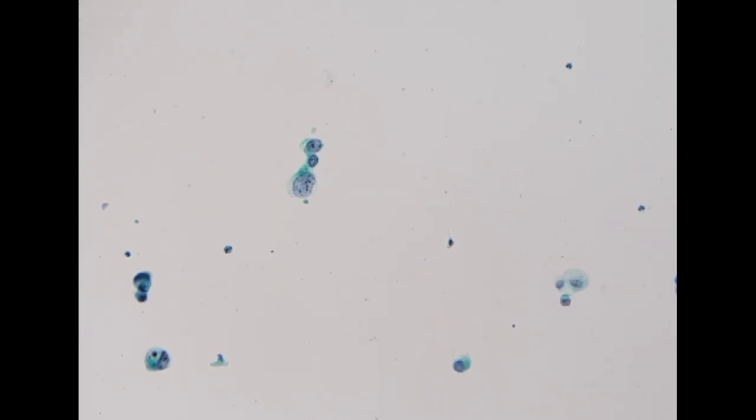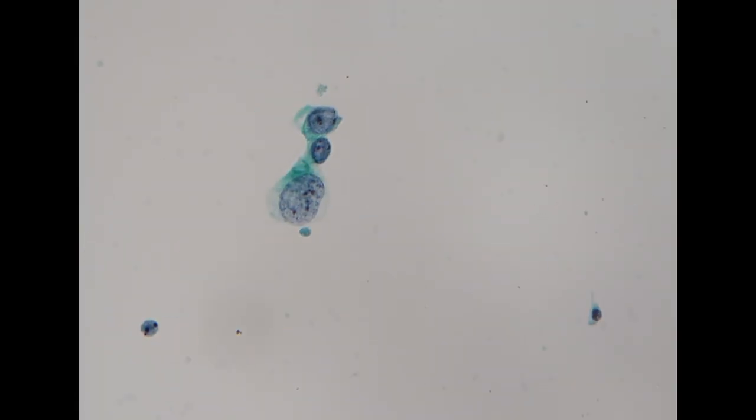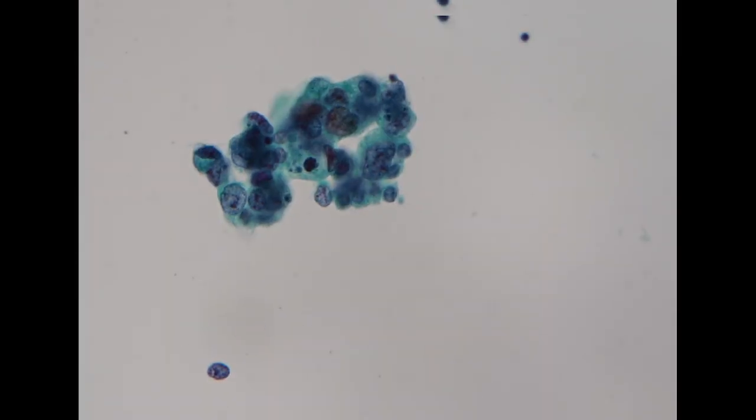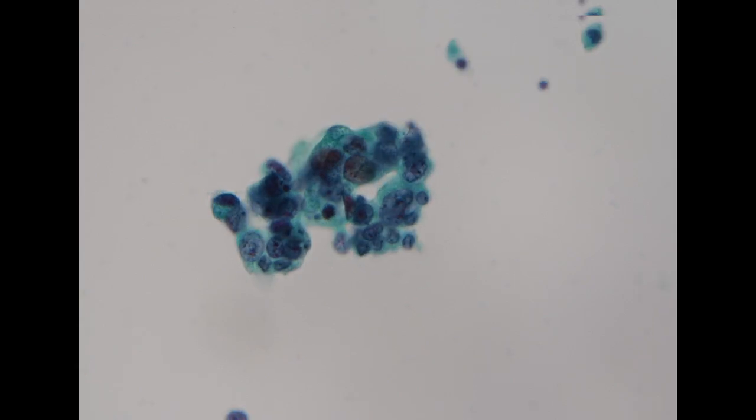So these cells in the background showing this single cell pattern are easy for the diagnosis, compared to the aggregates of high-grade urothelial carcinoma cells. Sometimes in aggregates of cells it is not easy to see the cytologic detail.